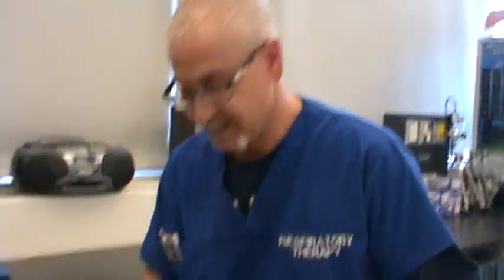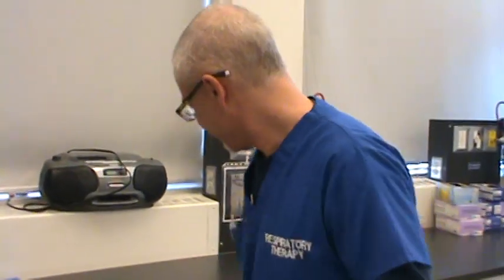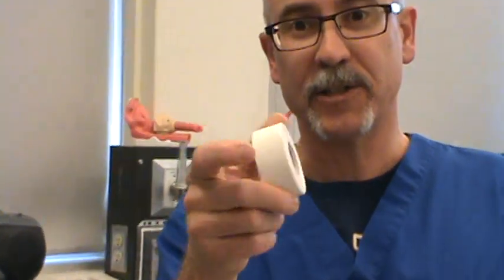So some of the things that you're going to need: a pair of scissors. I don't know why they call it a pair of scissors, it's only one, but there's two sides to it, so that's probably why it's called a pair. Some tape, 1-inch cloth tape. All hospitals have it.